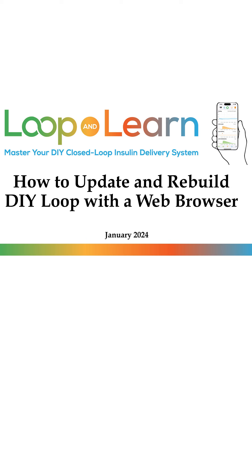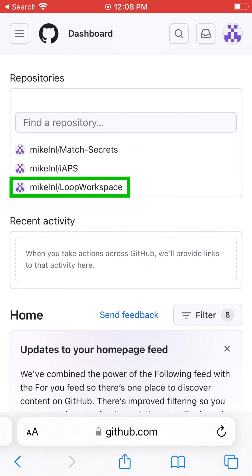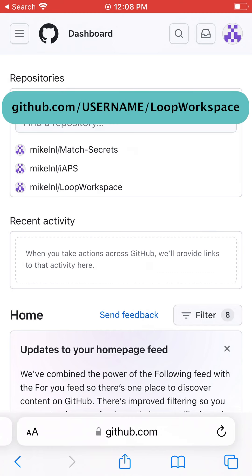Let's jump on over to github.com and tap your GitHub username forward slash LoopWorkspace, or you can get there directly by going to github.com forward slash your GitHub username forward slash LoopWorkspace.